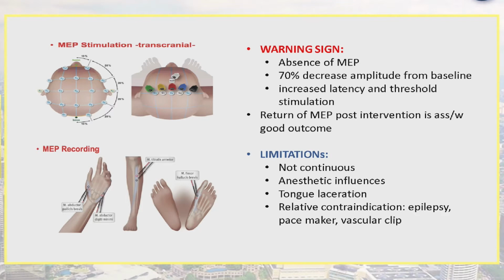However, for MEP, the decrease should be more than 70% amplitude from the baseline. And there is a possibility, if the latency increases or the threshold stimulation increases, that we must suspect the area is being damaged, either from mechanical, thermal, physiological, or surgical causes. And some people said return of MEP post-intervention is expected with good outcome, which is very good. So we can see the changes that happen during the operation that impact the post-operative outcome.